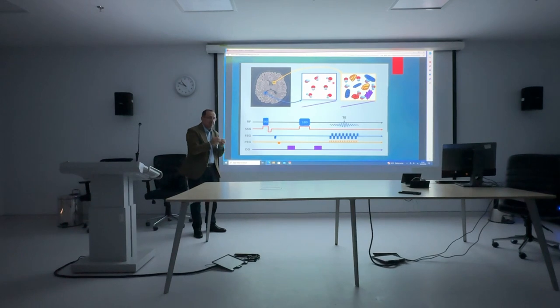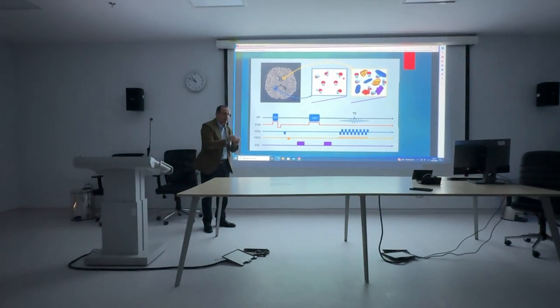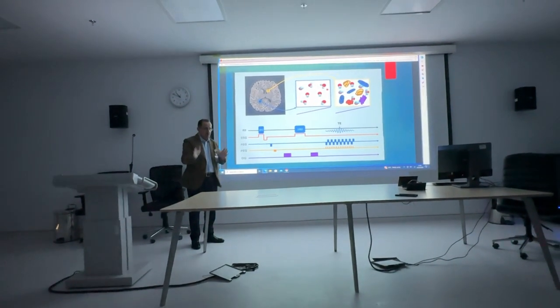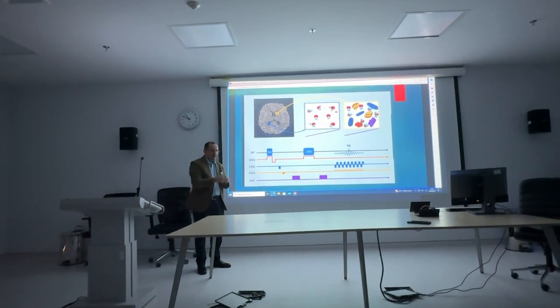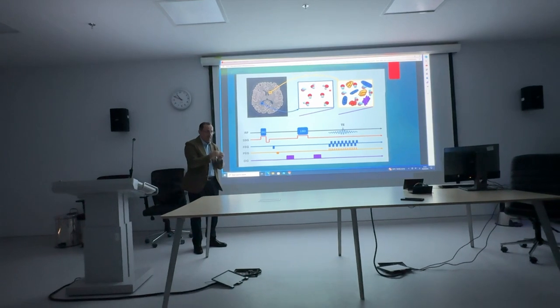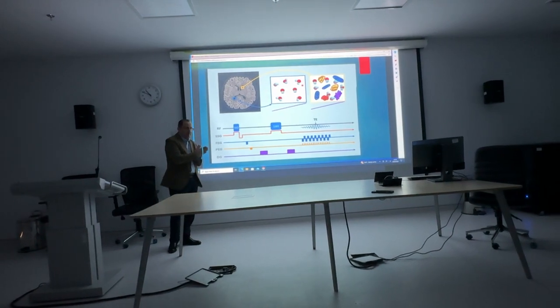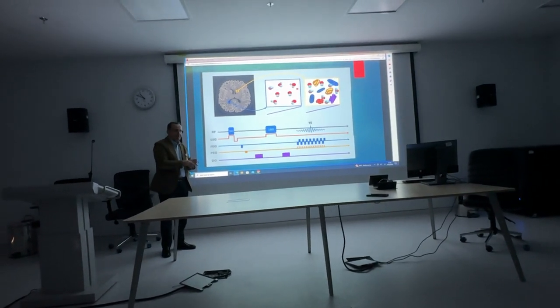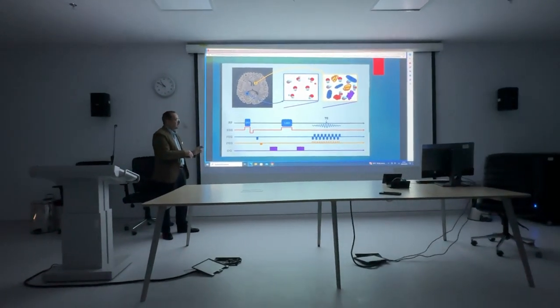The tissue is not responding to dephasing, and so we are having a high signal. So we are left by this sequence with marked loss of signal for the free diffusion and marked bright signal for the restricted diffusion, and this is what we want. You understand the idea? Yes. Stationary particles do not respond to the gradient due to stationary position, and what will happen is just having almost high signal due to the refocusing 180 pulse, which doesn't affect the diffusion capability. Motion particles will be affected and go into a marked dephasing phase, which is loss of signal, and this is achieved by this brilliant, let's say, technique to accelerate the dephasing and loss of signal.